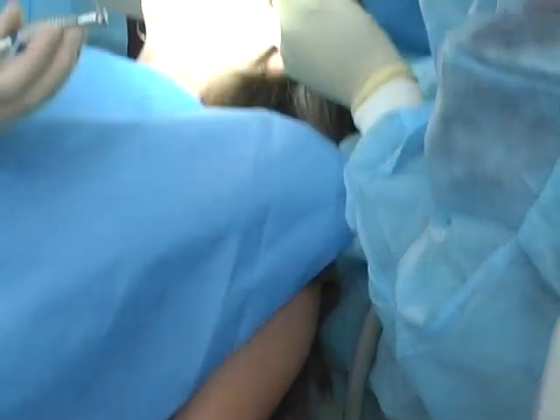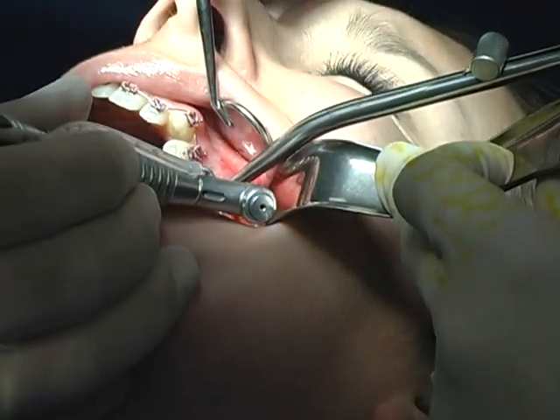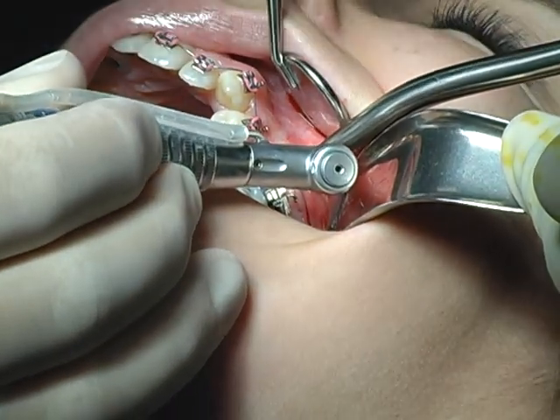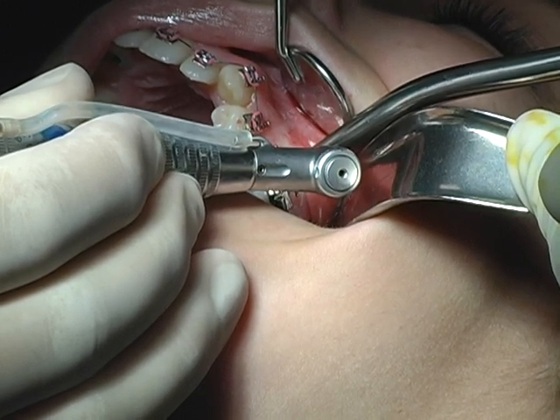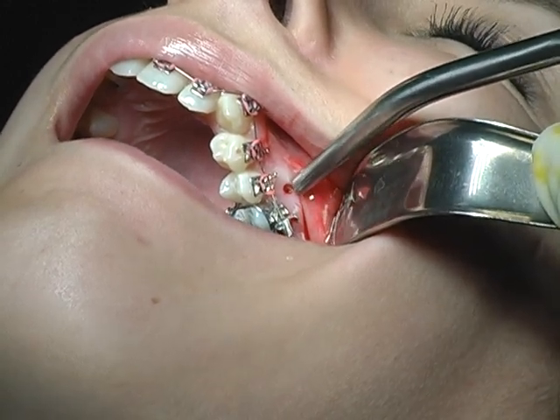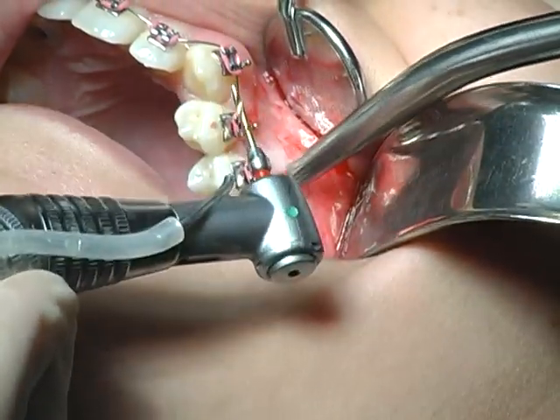We adjusted the speed to 850. Remember what I said before — it's not difficult to do, but it's more important that we have the right direction. It has to be the right angle. We don't go to the right and don't go to the left, and we would like to sense the density and thickness. There was already the preparation with the round drill, so it's perhaps a millimeter. The bone is not too dense, so I will take the 1.1-millimeter drill.